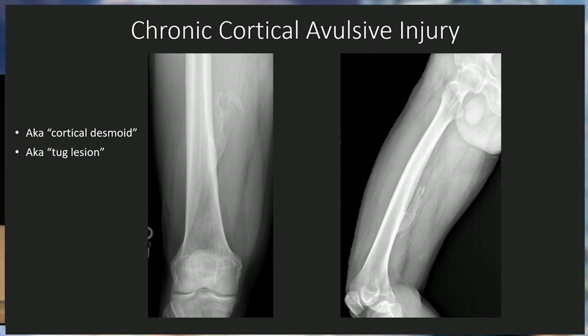There are a lot of attachments there, along the posterior aspect of the femur, the linea aspera, one of which is a structure called the lateral femoral intermuscular septum. And patients, especially active ones at younger ages, will oftentimes overload that area. They're called thigh splints. And the periosteum has now formed new bone. But then they stop being active. They get into adulthood like most of us, and they stop exercising as much as they should. But that thing is still there, and they happen to get imaged for a different reason, and we see it.